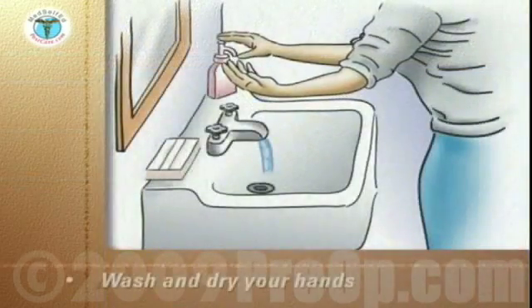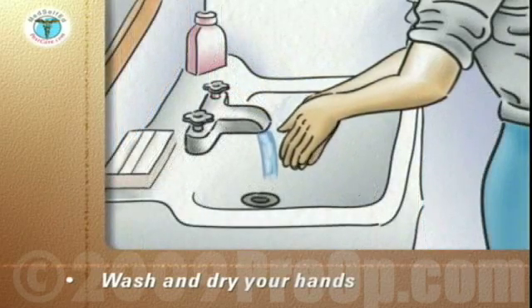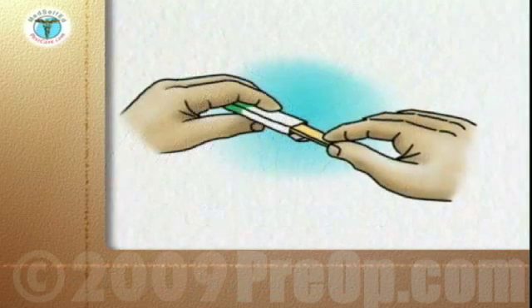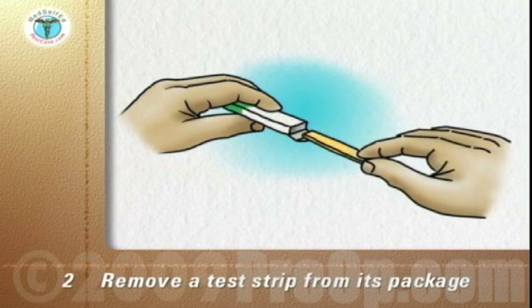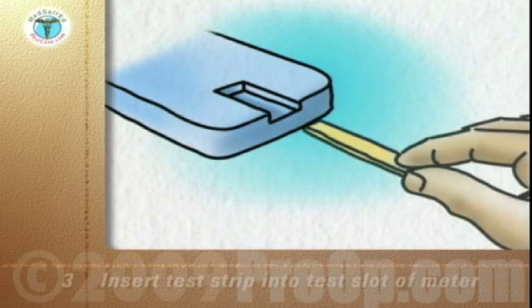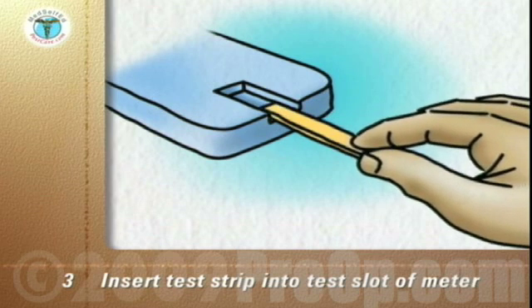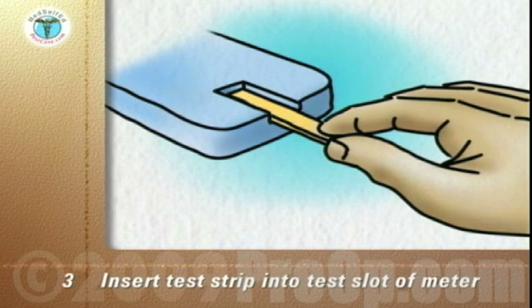Wash your hands vigorously with soap and warm water. Rinse and dry thoroughly with a paper towel. Remove the test strip from its individual package. With the meter off, insert the correct end of the test strip into the test slot of the meter according to the manufacturer's instructions. This usually turns the meter on.